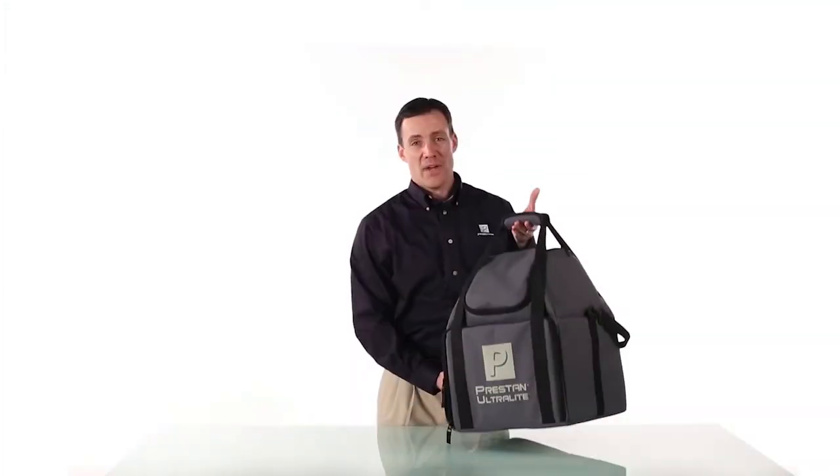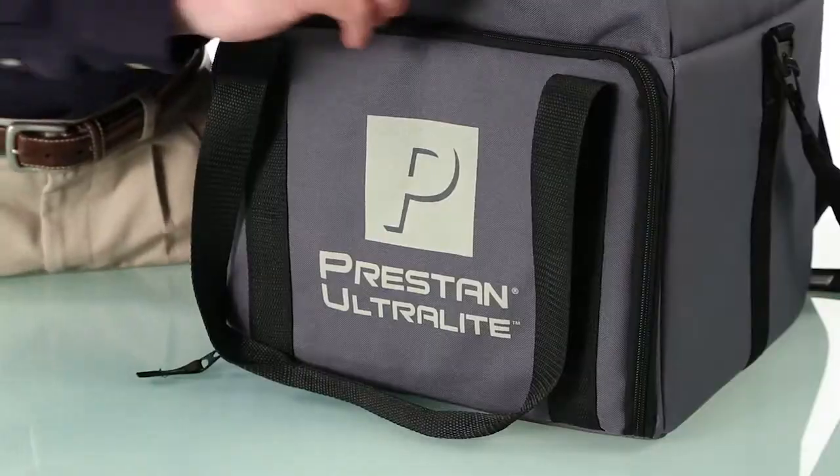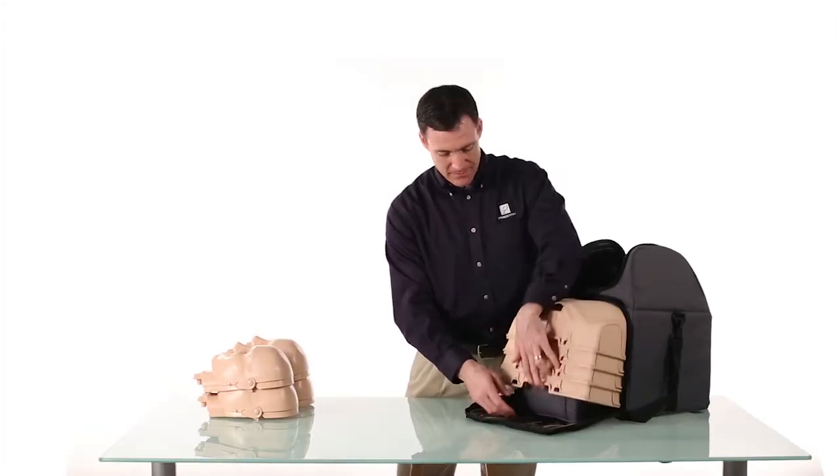This lightweight, easy-to-carry bag contains four mannequins with stackable heads, torsos, and compression pistons.